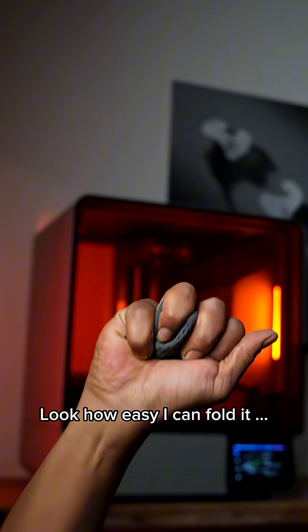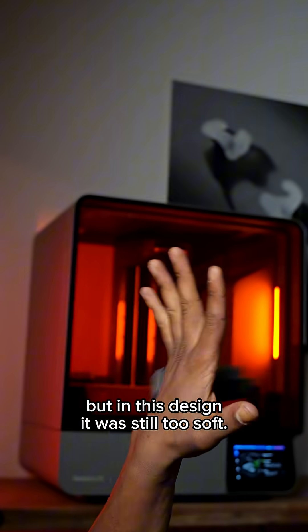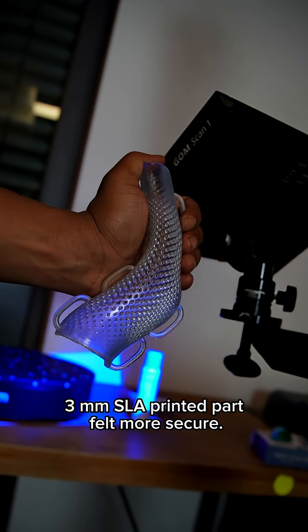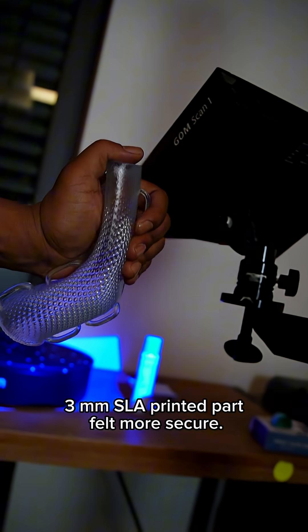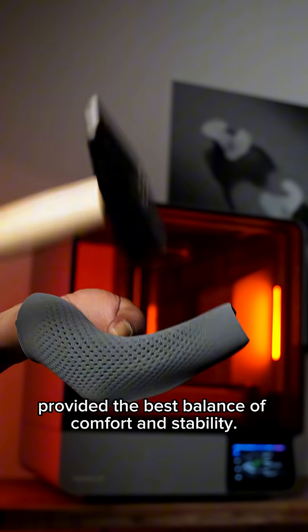Look how easy I can fold it. The 3 mm version provided better support, but in this design it was still too soft. The stiffer, impact-resistant 3 mm SLA printed part felt more secure. The 4 mm orthosis printed in TPU provided the best balance of comfort and stability.